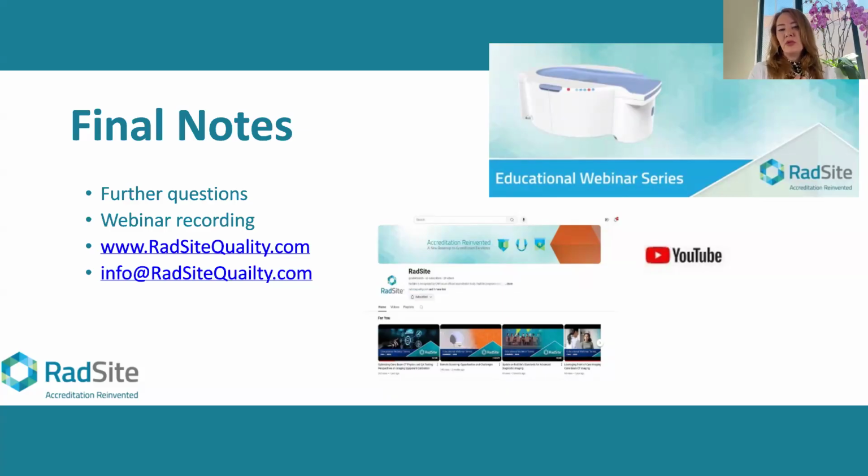And then of course we do utilize contrast, so we do have to have an MD present for the contrast, and then we have to have a staff member who can put in the IV. And dealing with issues, we're always ready for contrast. We're very much educated on contrast reactions and everything that you have to do to be up to date on that. But if you're not using contrast, infinitely easier as well.